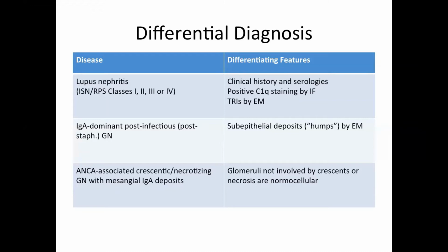When we have IgG as well as IgA. Of course, the IgA has to be dominant. Okay, IgA and lambda. But if we have some IgG as well, for example an intensity of 1 or 2, this means a more aggressive or more active disease. This is what the studies have shown.